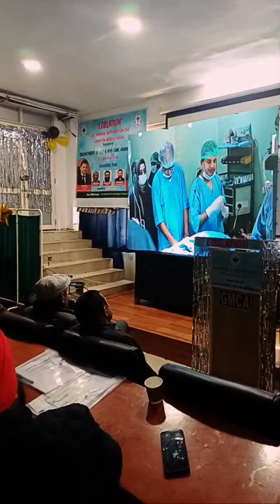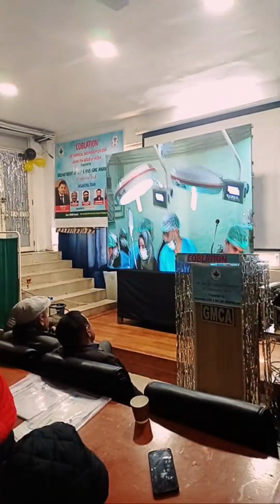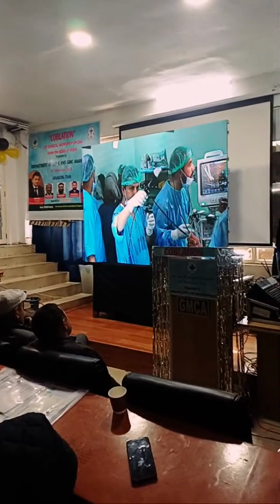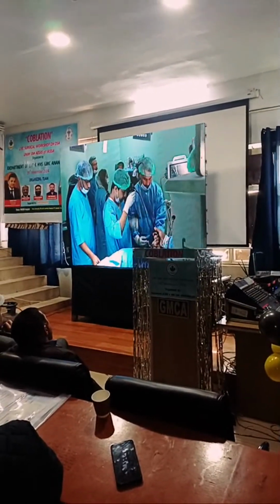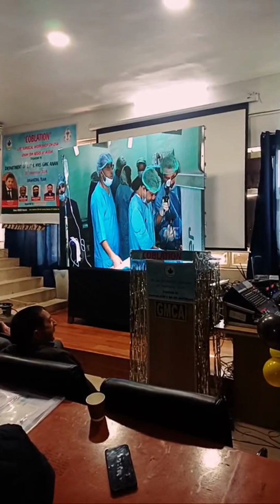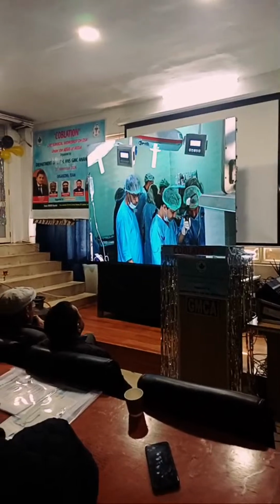Nose drop, please. Can I have the microscope? Flexible scope. Just monitor. Hello, Dr. Ankit, you are having some photographs. It's a very thick scope of this patient.